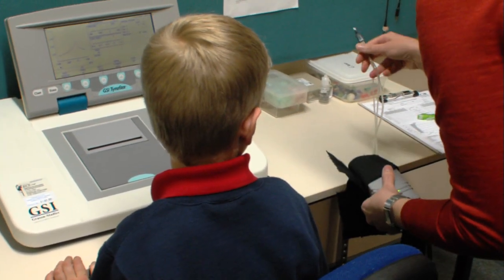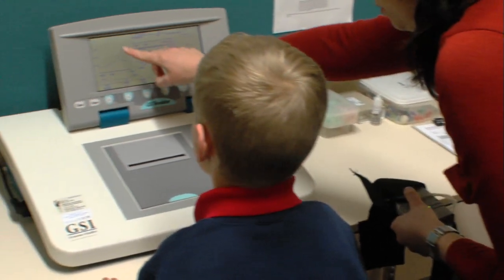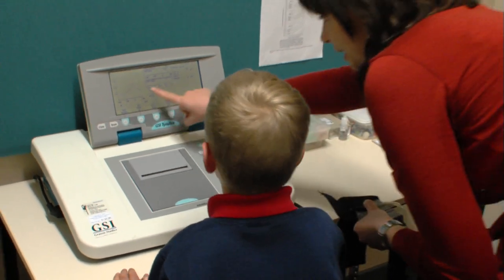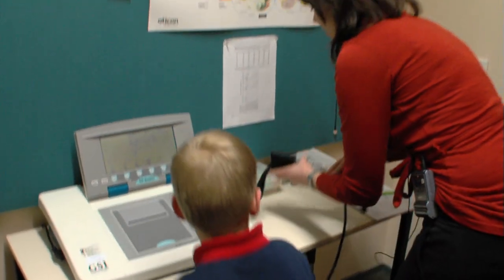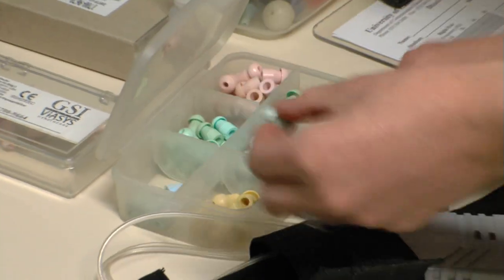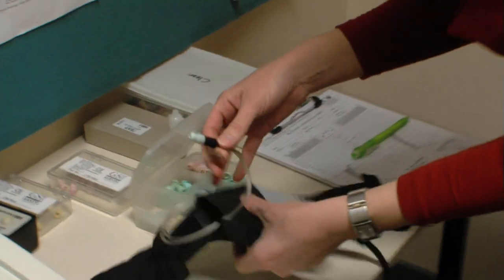I'm going to put a wee tube on the end of this and pop it in your ear. We're going to see if your ear can draw us a picture. And what we're hoping for, Angus, is that we can get a nice mountain picture from your ear. All right, so you've got to sit nice and still, and we'll see what picture we get drawn. Let's give a blue one a try. It's a nice and soft wee tip. Let's pop that on your shoulder. There we go, nice and comfy.